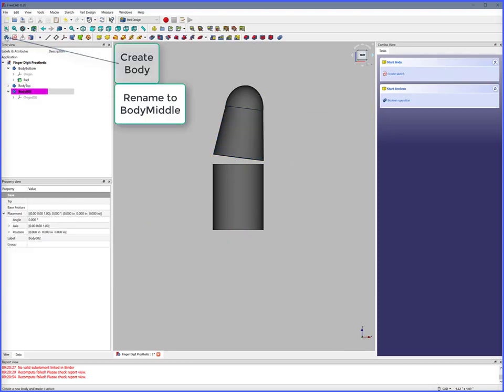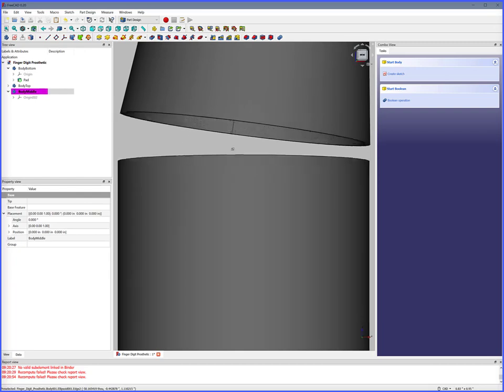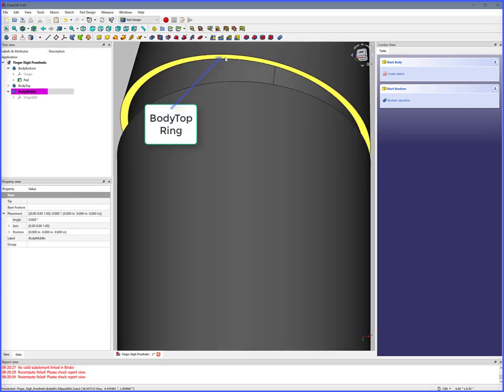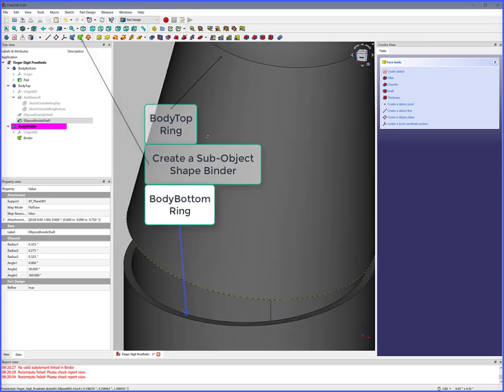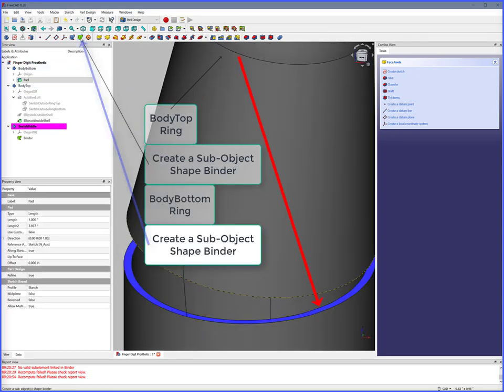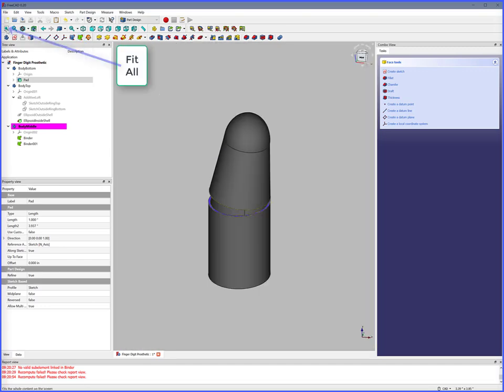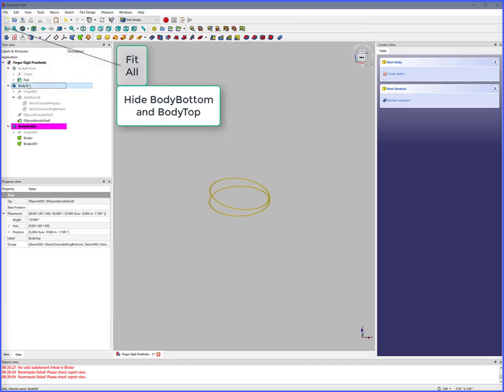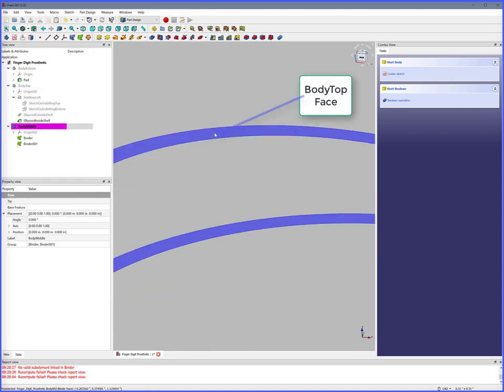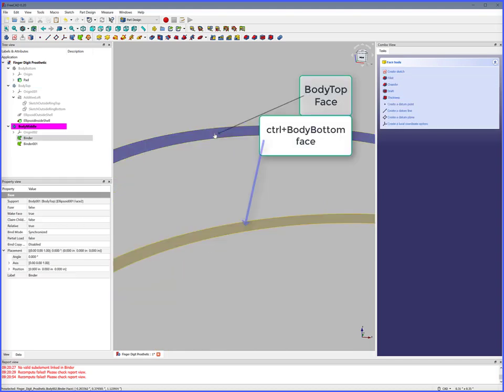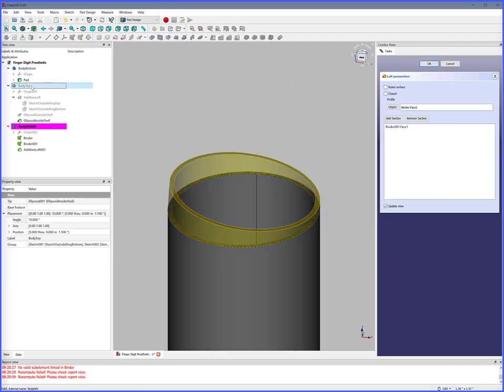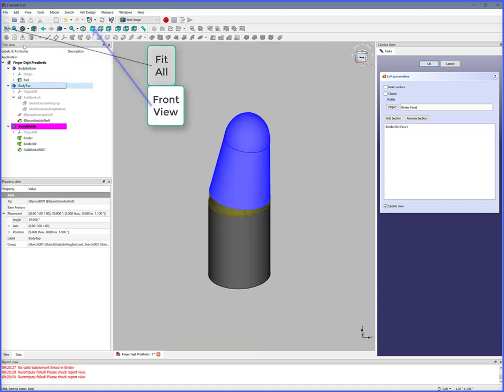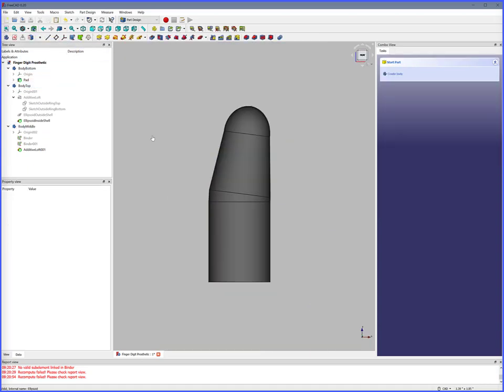Create Body, rename to Body Middle. Zoom in. Select Body Top ring, create a Sub-Object Shape Binder. Select Body Bottom ring, create a Sub-Object Shape Binder. Fit all. Hide Body Bottom and Body Top. Zoom in. Select Body Top face, holding the Control button select Body Bottom face. Additive Loft. Fit all. Show Body Bottom and Body Top. Fit all, Front View. The Body Top has been connected to Body Bottom.